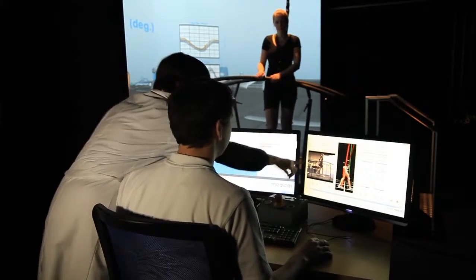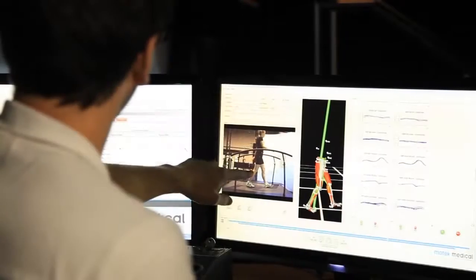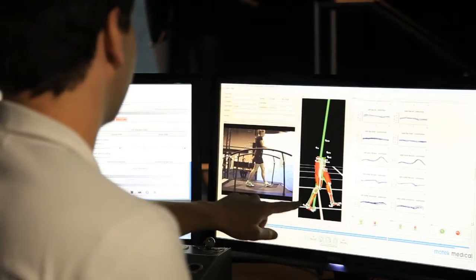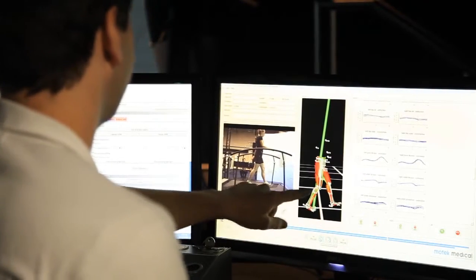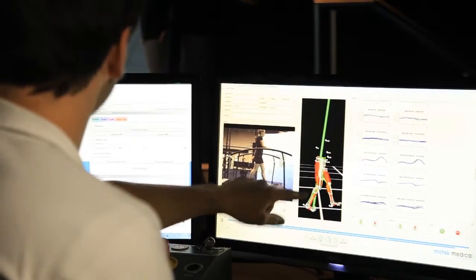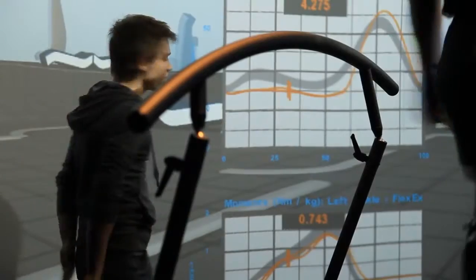Data is recorded and combined with images from 3 video cameras, so it may be analyzed offline and presented as a gait report using the gait offline analysis tool.